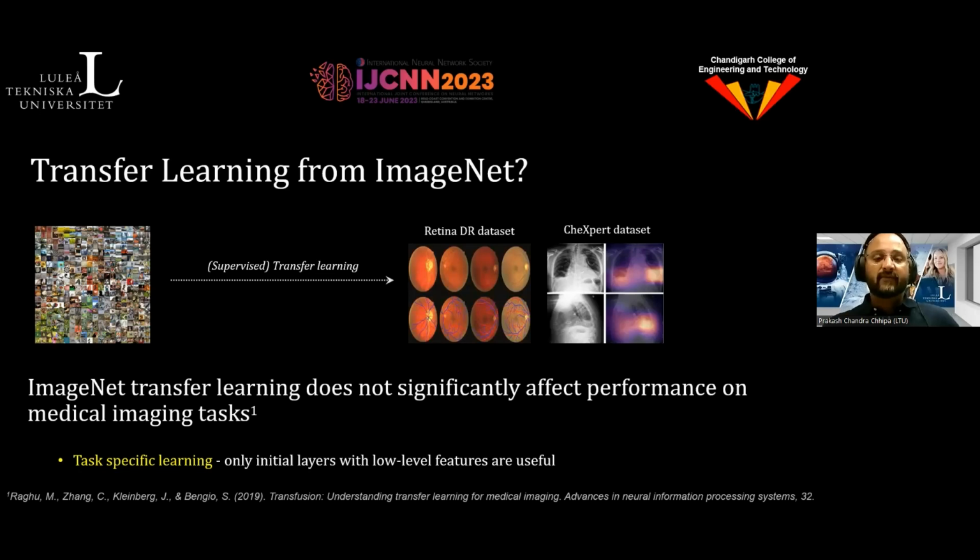Several studies have been done to understand the transfer learning perspective. The main point is that knowledge transfer from natural scenes to medical images is not the direction in which we could improve downstream task performance, so it is necessary to introspect and identify the direction in which we could move forward.